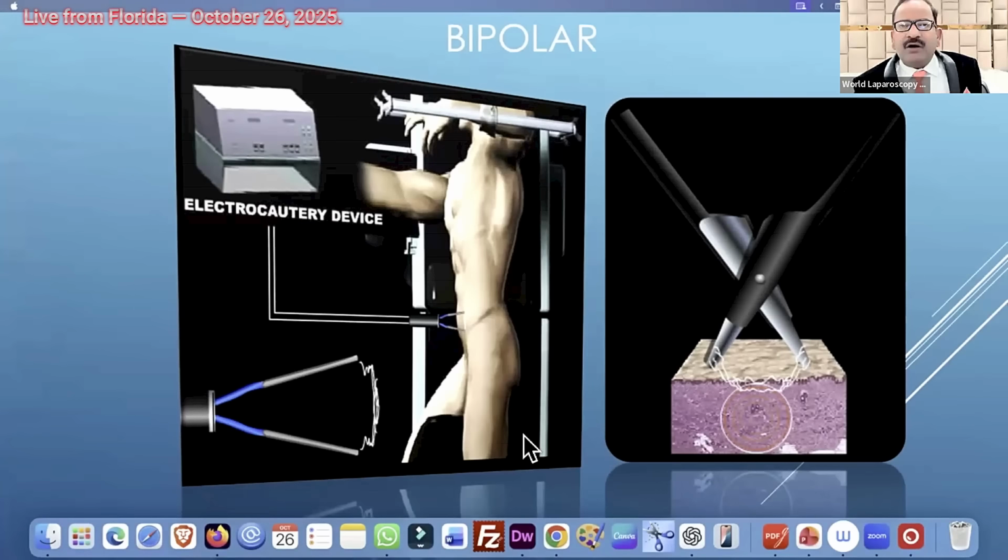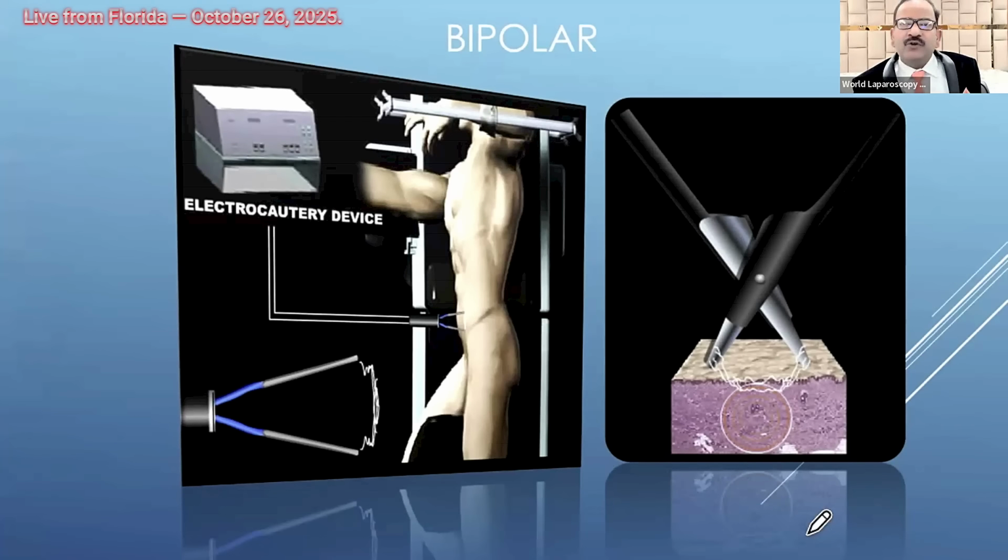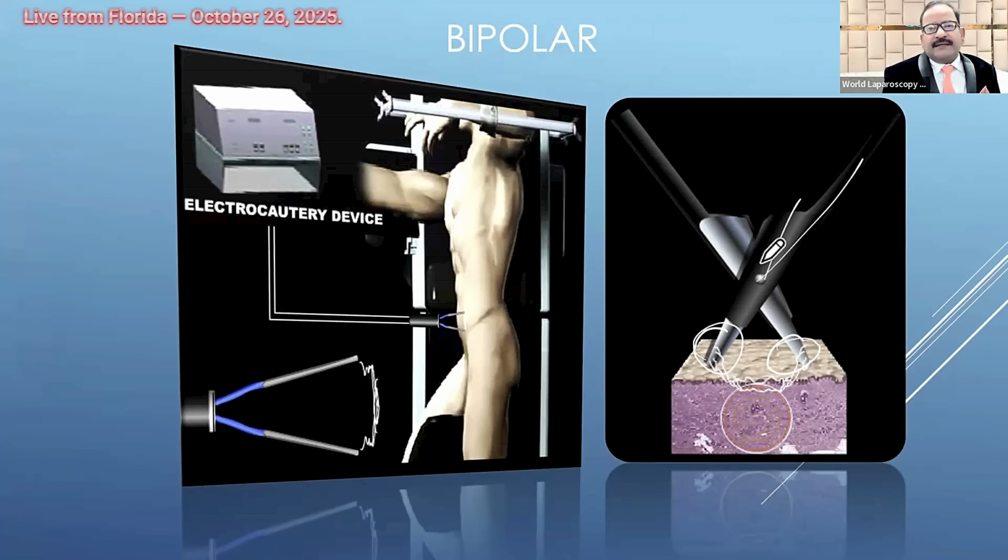Exactly the same way we have a bipolar scissors. So this way bipolar has only a few instruments. By default all the other instruments are monopolar. So these are a few of the problems of the bipolar. Scientists have tried to make bipolar scissors. In these scissors only the tip is metal and here it is plastic. What happens is, if both are metal, it gets short circuited there. So bipolar has to be especially designed.